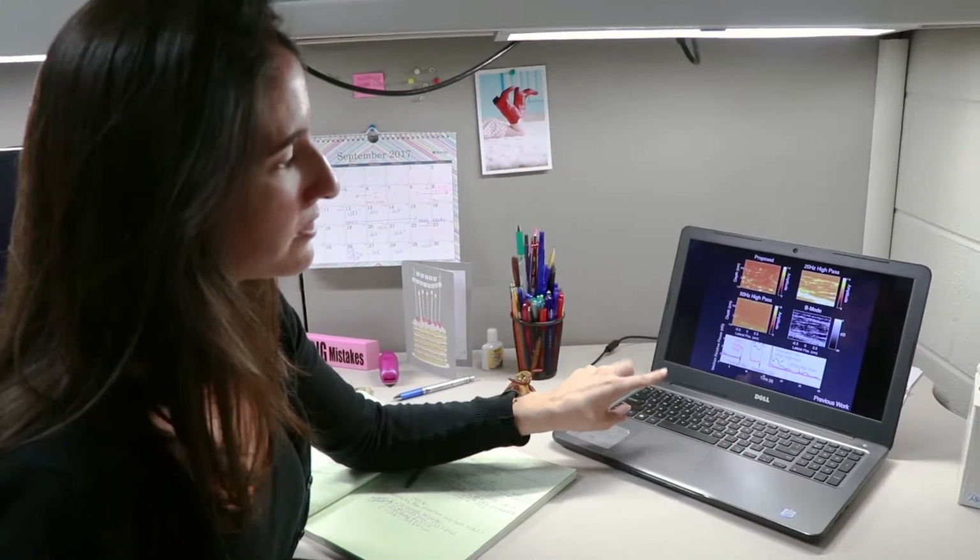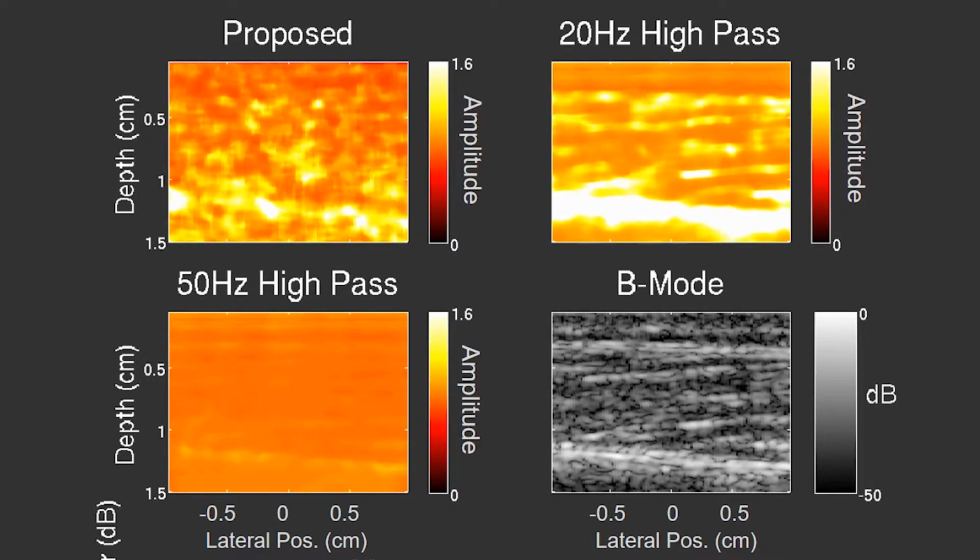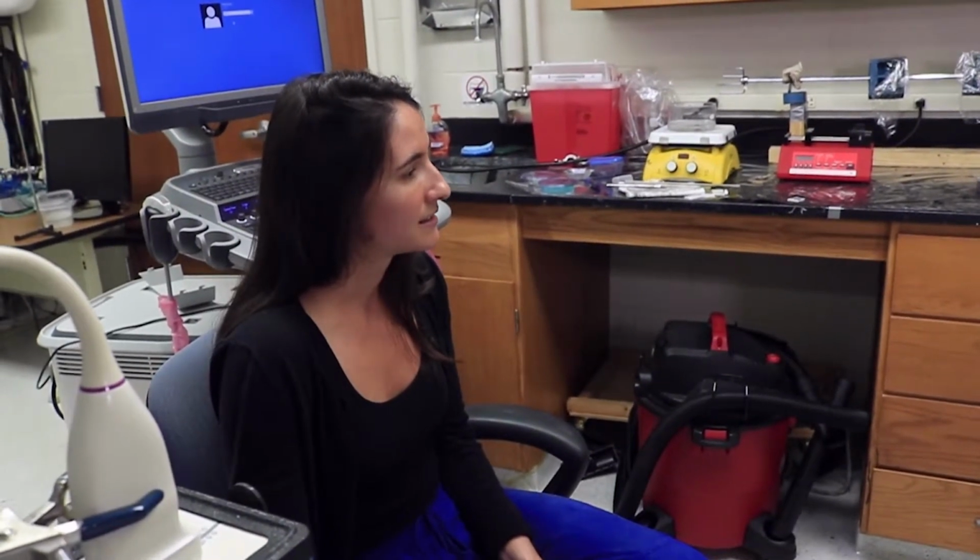Okay, so I work on improving slow blood flow imaging or perfusion without the use of contrast agent. Perfusion is important because it involves the exchange of nutrients from the blood to tissue, and conventional blood flow imaging is not so great at perfusion imaging for really two main reasons. One being that blood signal is much weaker than tissue signal. And the other problem is that tissue moves, and so that makes separating the tissue and blood signal really difficult. And so we're working on a signal processing technique to better separate the tissue and blood.